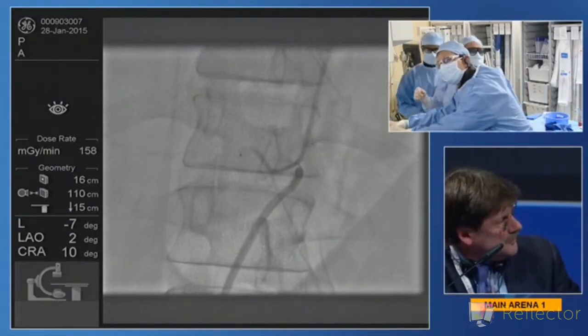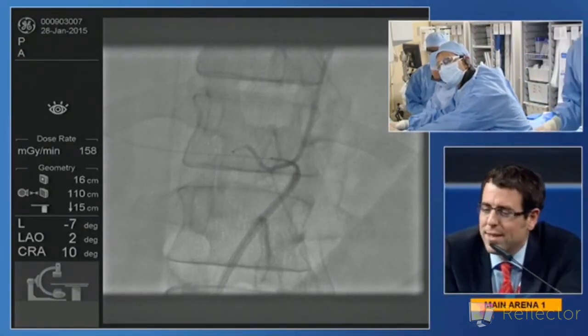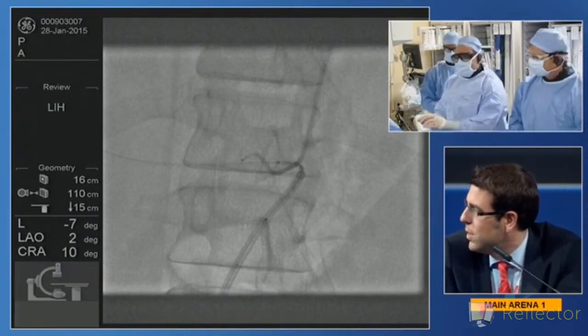I would try to get the splenic artery from below, with one of these wires. With the torque device first. We're ready to go with the splenic artery embolization, the plug first, and then go for treatment of the hepatic.